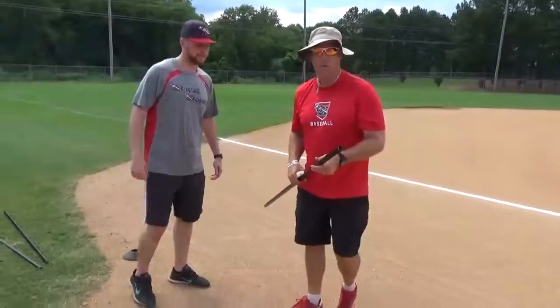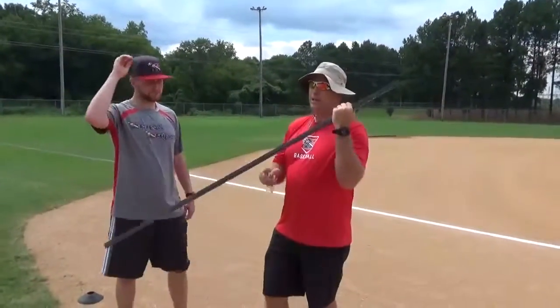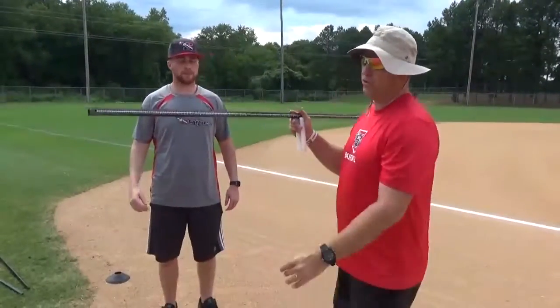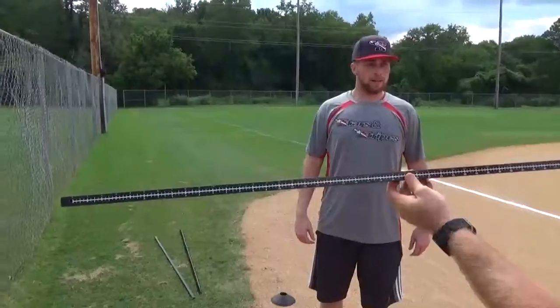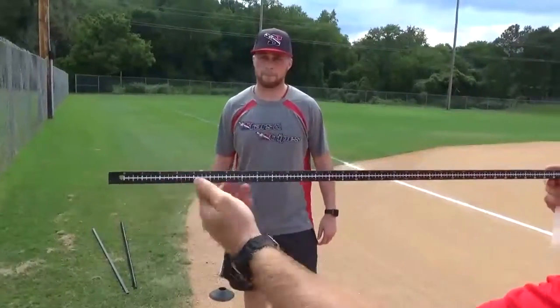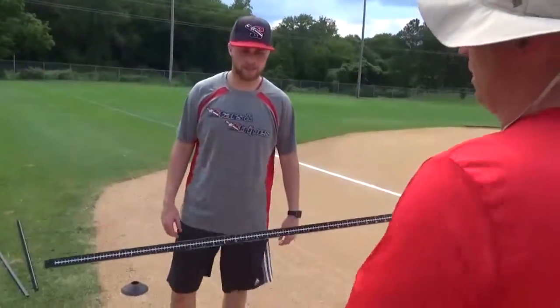We're setting up the station on the shoulder flexibility. On the shoulder AccuFlex 2 you have white and yellow numbers. We use the white numbers — that is the inches. Everything should be facing you when you're administering it.